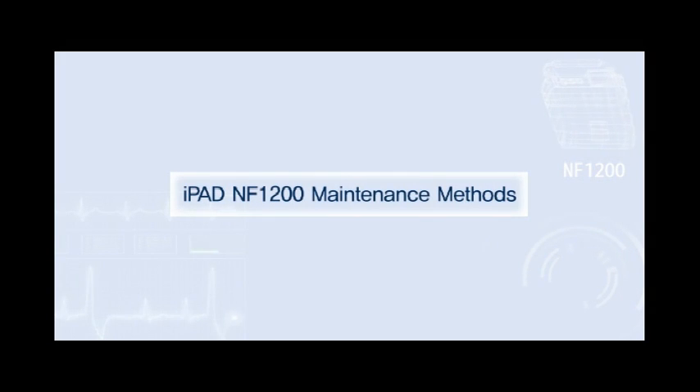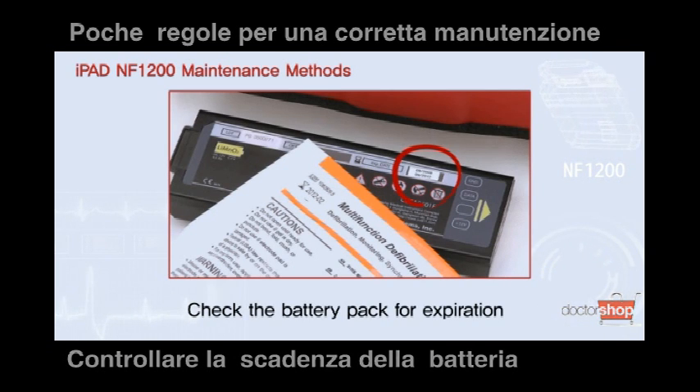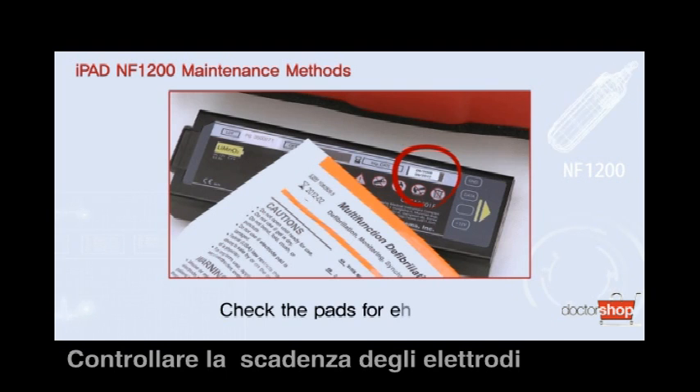Check the battery pack for expiration. Check the pads for expiration.